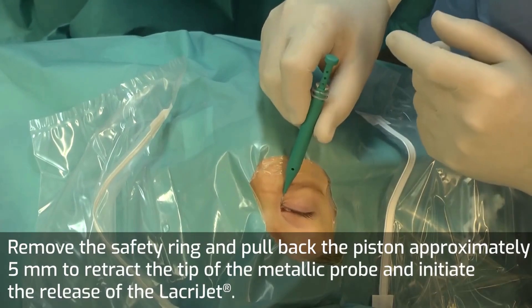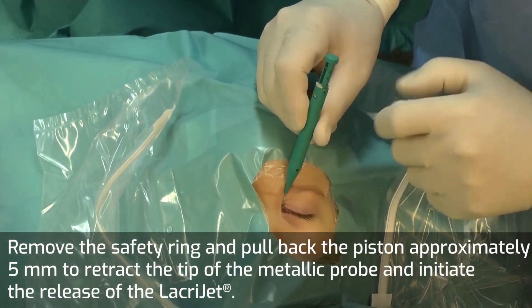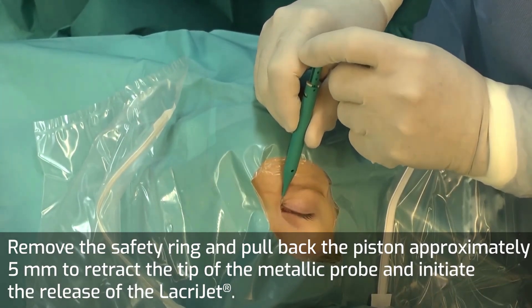Remove the safety ring and pull back the piston approximately 5 mm to retract the tip of the metallic probe and initiate the release of the Lacrijet.